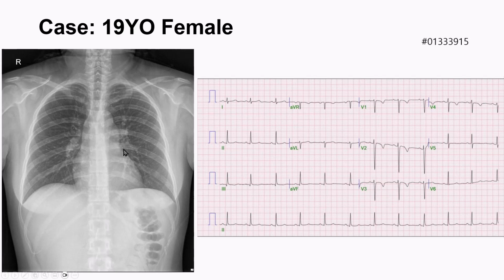The ECG showed a similar finding, but there was T-wave inversion in V1 to V4.